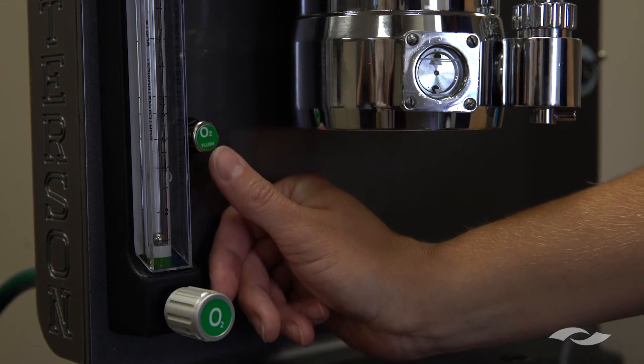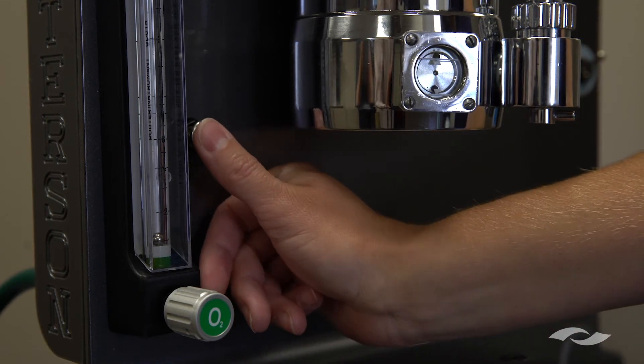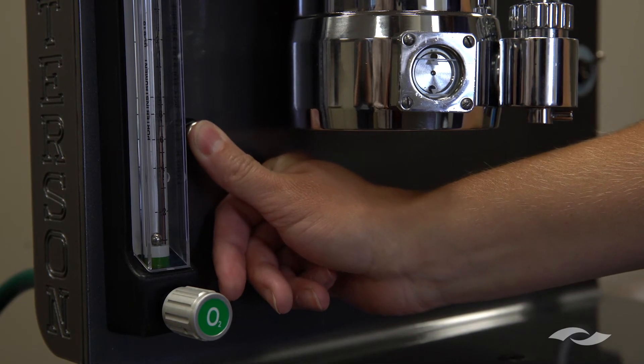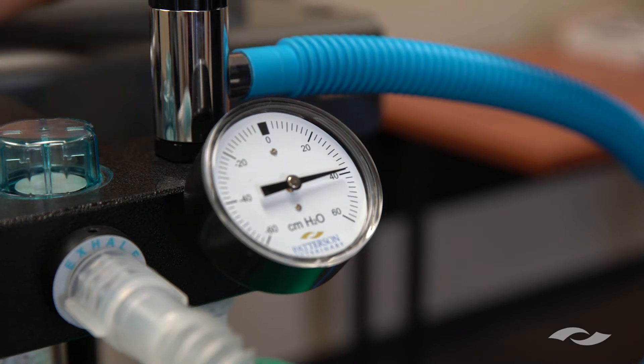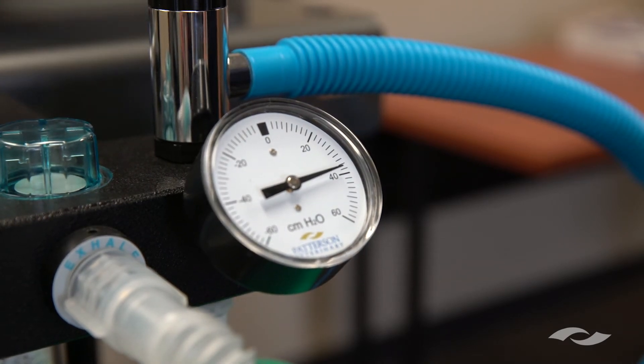The next step is to press the O2 flush button and introduce oxygen into the system. We're going to keep watching the manometer as it gets up to anywhere between 30 and 40 centimeters of water. The goal is that it does not drop more than five increments in 20 seconds.